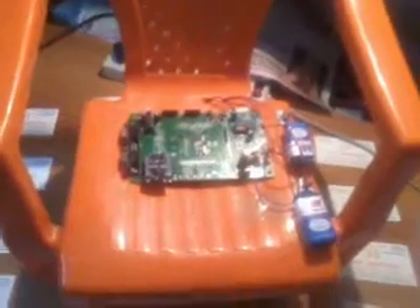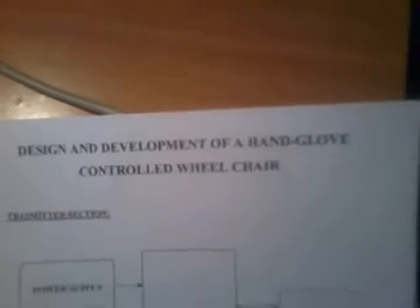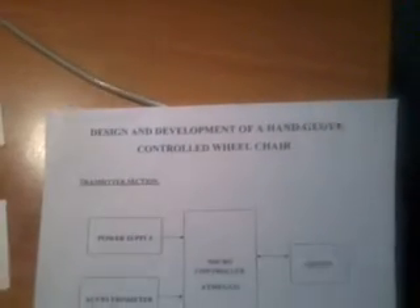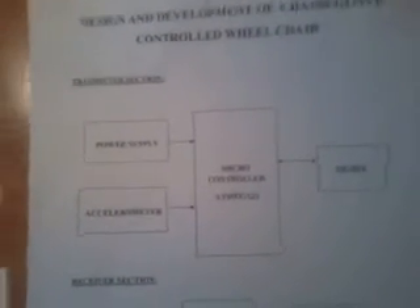Good morning, we are from SVS Embedded. The project title is called 'Design and Development of a Glove Controlled Wheelchair.' In this project we are using an ATmega32 microcontroller in the transmitter section.